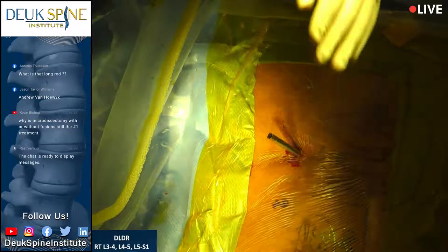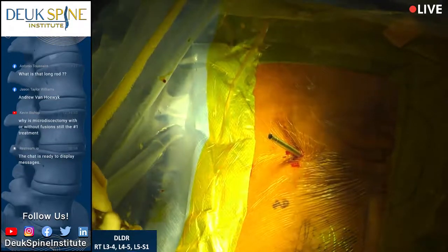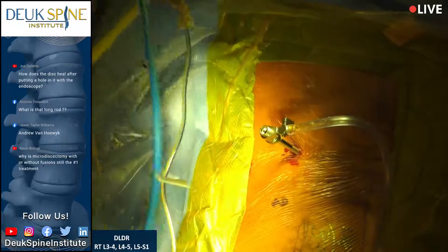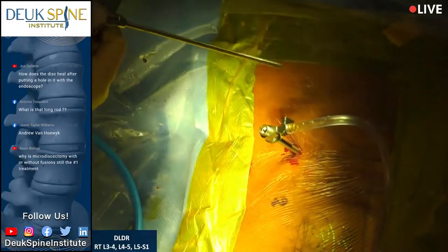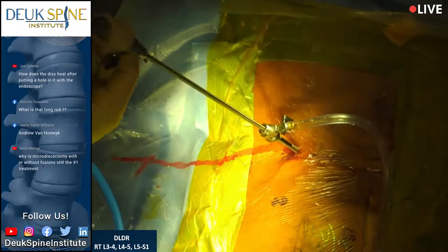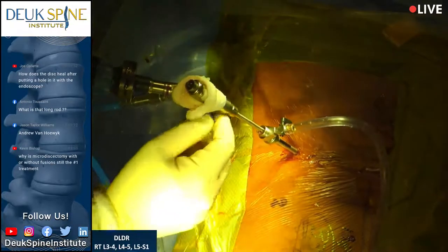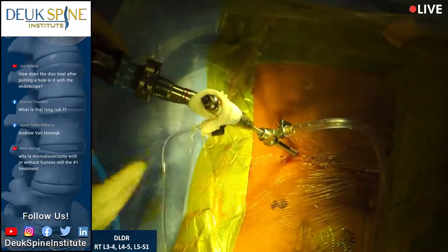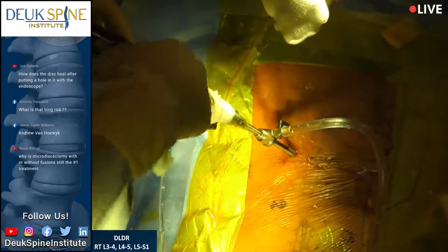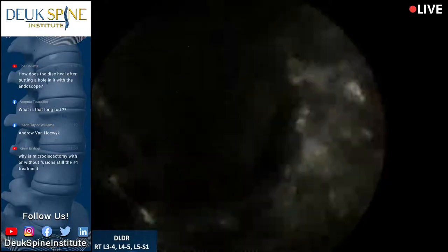Okay, this is the last disc. This is the L3-4. We know this is causing his pain, 10 out of 10 pain, because we tested the disc earlier. And the pain is called concordant. Concordant just means the same pain the patient has every day, the pain they want to get rid of. Why is that important? Because people have pain for different reasons. The herniated disc is the most common reason people get back pain or neck pain, but there's other causes of pain, and you want to make sure that you're operating on the right thing. If they don't have disc pain, then operating on the disc won't fix their pain. So the discogram is a good confirmatory test that tells me that we are operating on the right thing.